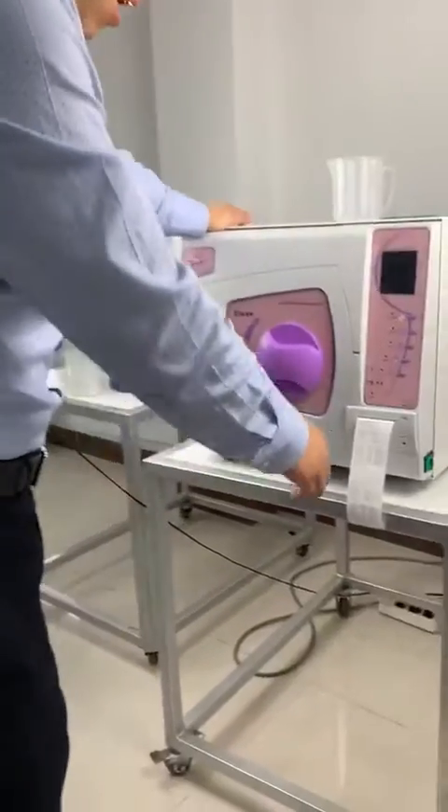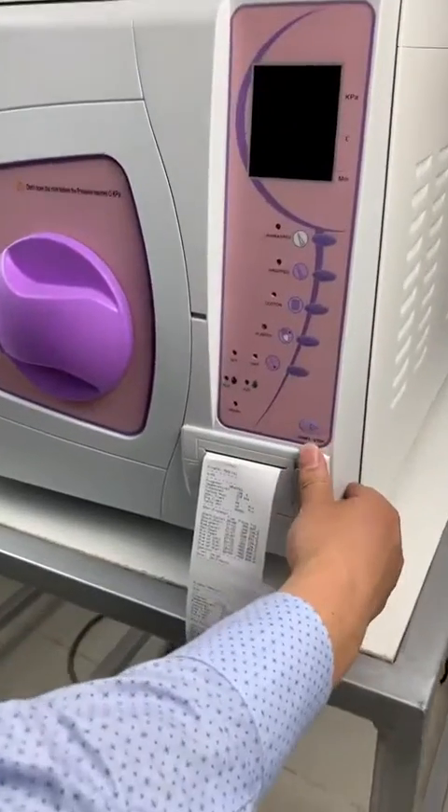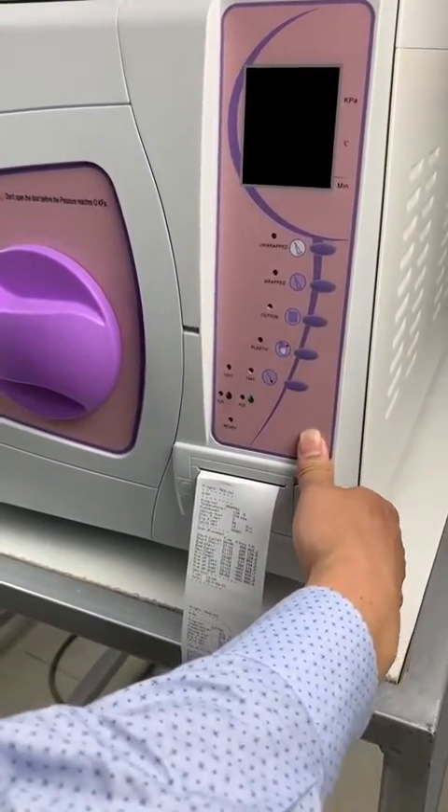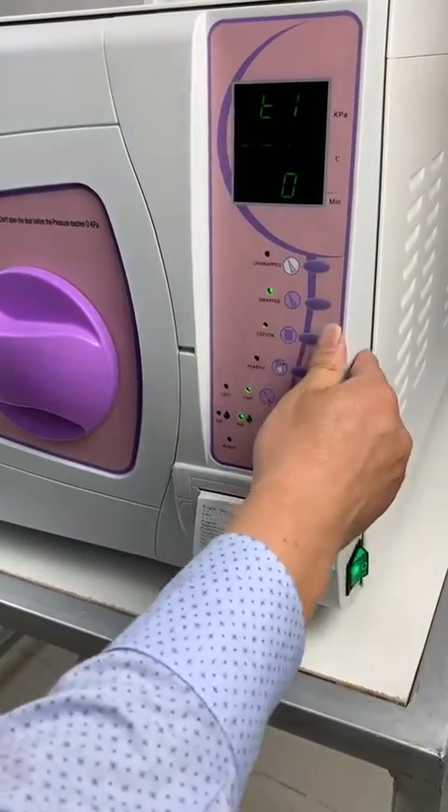Hello, let me introduce you how to set the time. First, long press start and then turn on the machine and then release the hand.